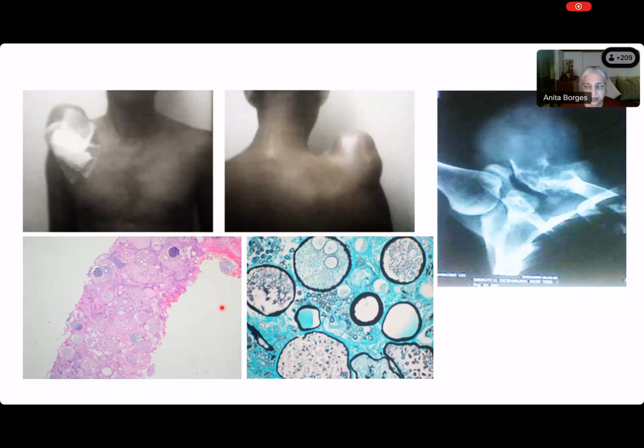Loudly? What stain is this? The green stain? It's green and there is black. Okay. So what stain do you think it is, Prayas? All right. Let's ask Sarangi, what stain is this? The one on the left is obviously an H&E. Yes. And the one on the right is what, Sarangi?